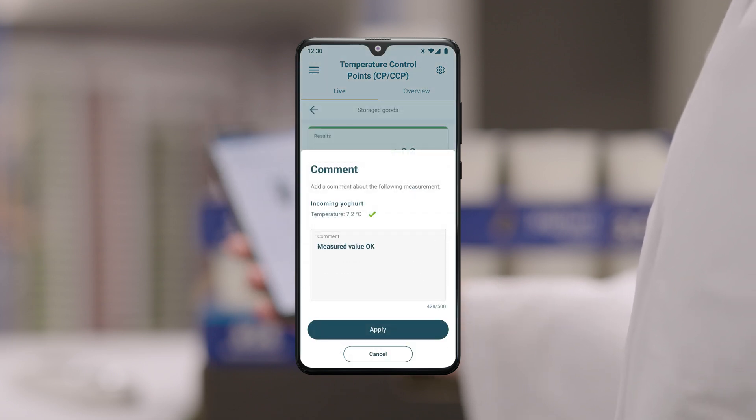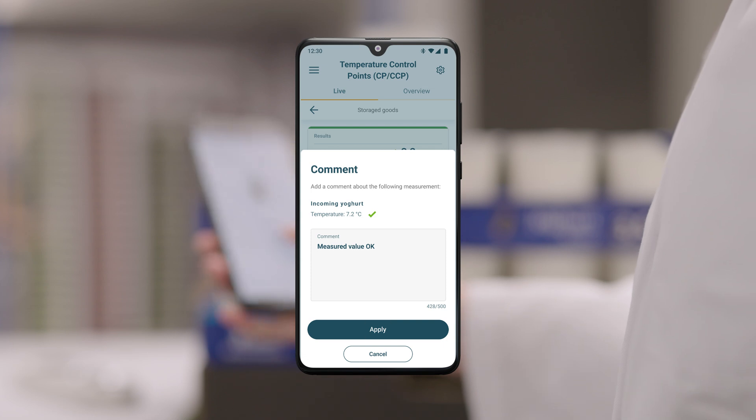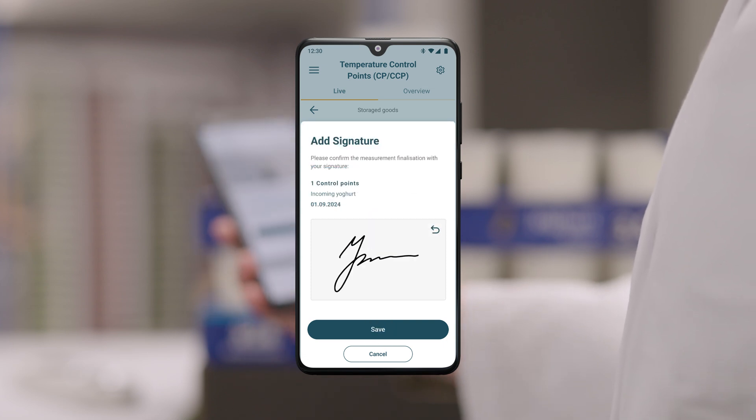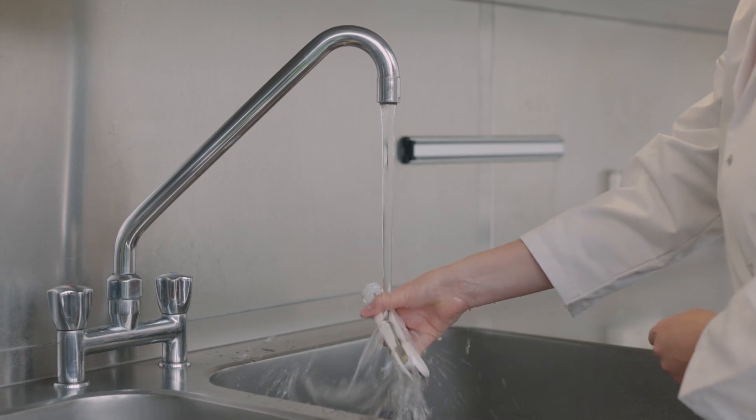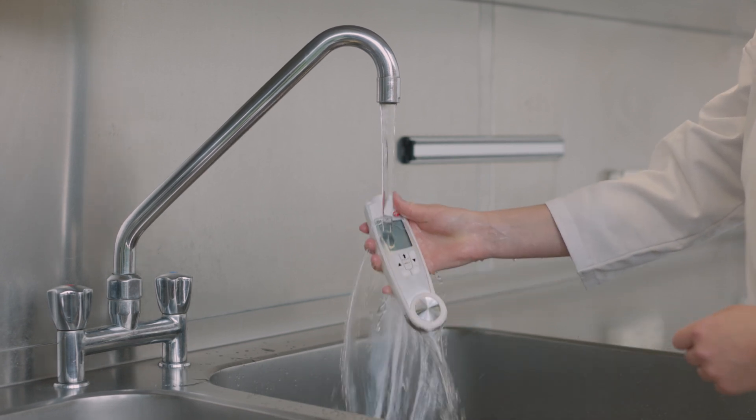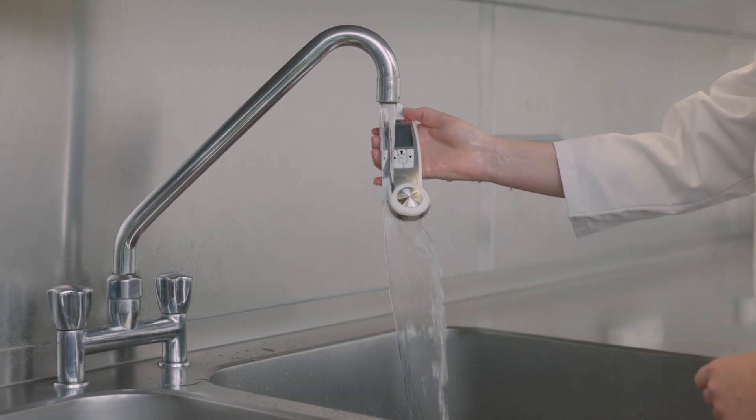After each measurement, you can optionally add an individual comment and complete it with a signature. Thanks to protection class IP65, the measuring instrument is protected against both water and dust and can therefore be easily cleaned under running water.